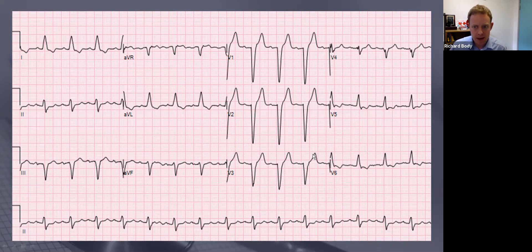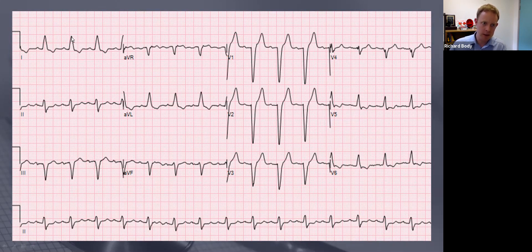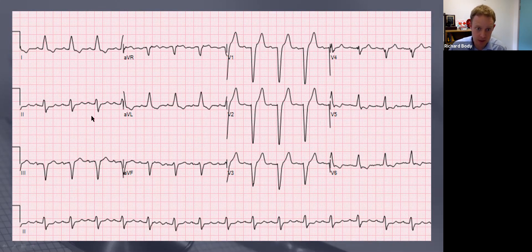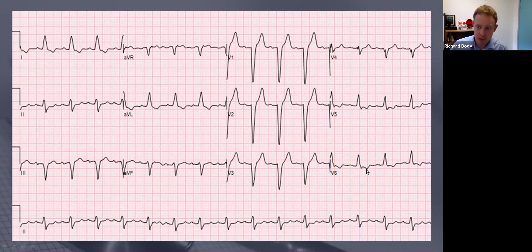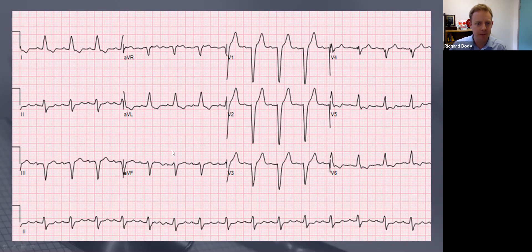So we've got left bundle branch block. The next thing to notice is the pattern: when the QRS complex is upright, we'll get ST depression and T wave inversion - and that's the pattern you'll notice all the way through these upright leads. ST depression, T wave inversion. When the QRS complex is down, you'll get ST elevation and an upright T wave, and that's exactly what we see.